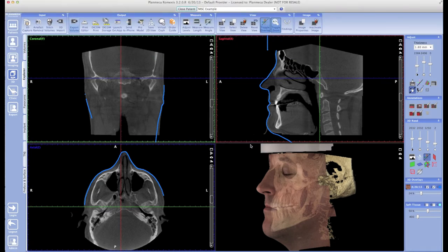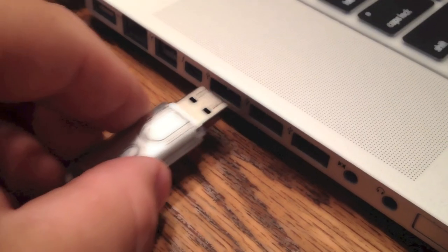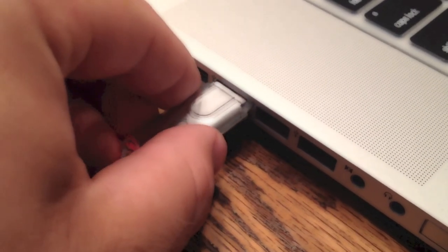Finally, last but not least, let's talk about getting the Romexis viewer and images onto a thumb drive. It's going to be similar to the process of burning it to a disc, except we're going to come down here and choose to Export the Viewer with the Multi-Frame Image. And that's it.